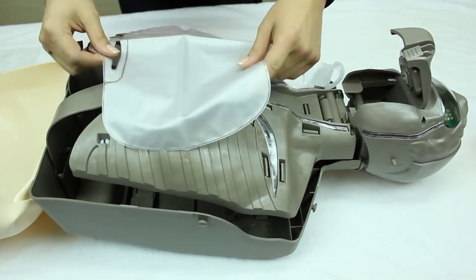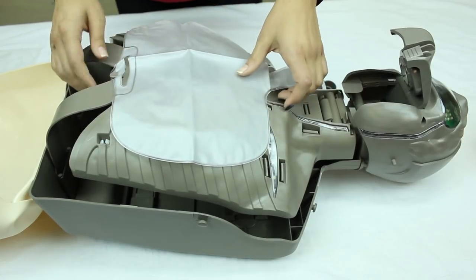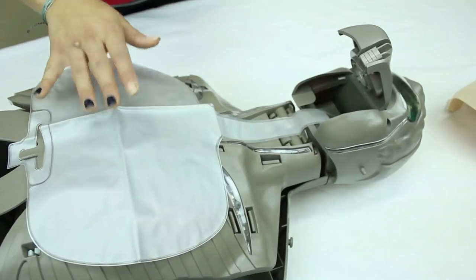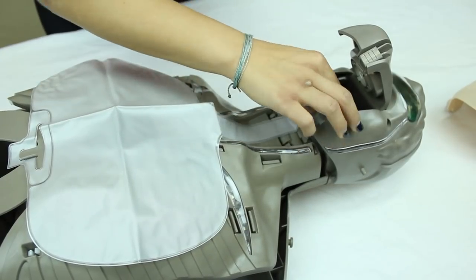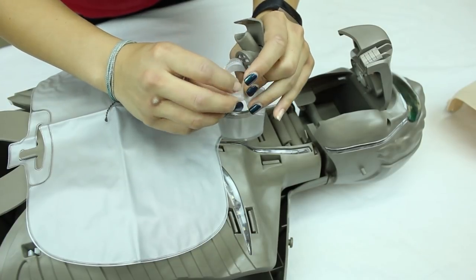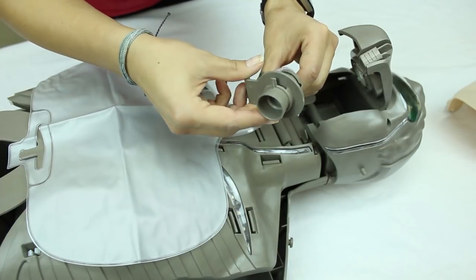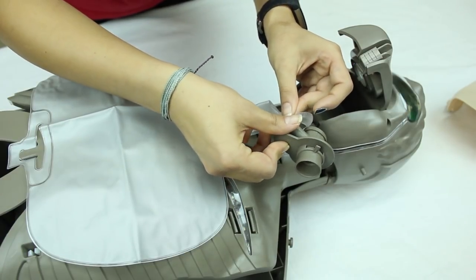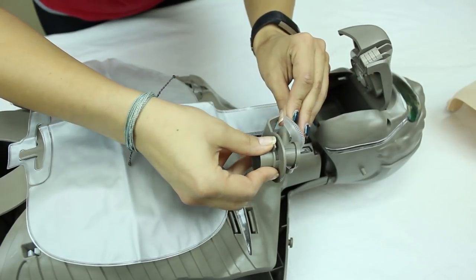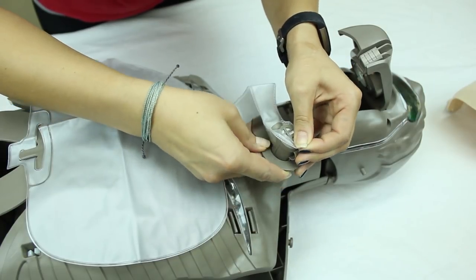To add a new lung bag, simply reattach it. Once the lung bag is attached, grab the mouthpiece and the airway. Open up the airway so you can attach it to the mouthpiece.